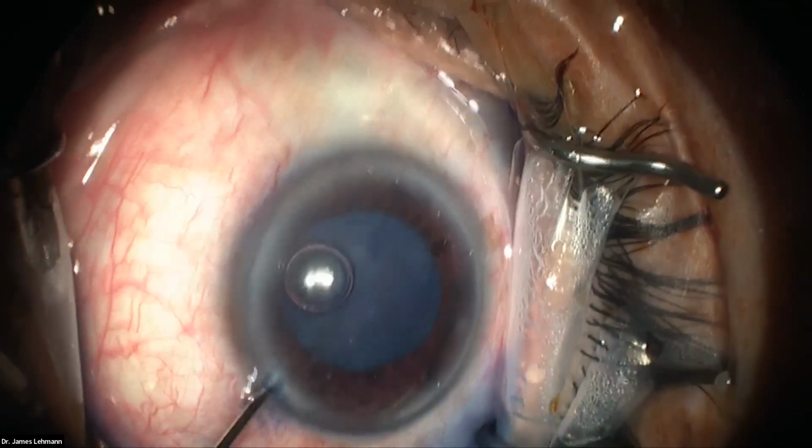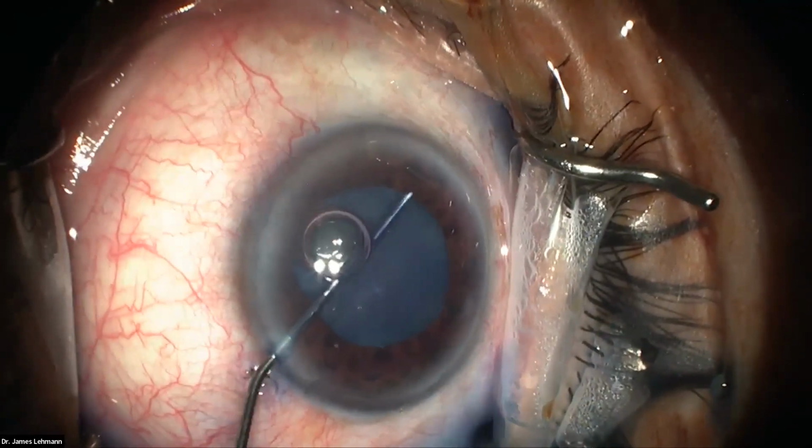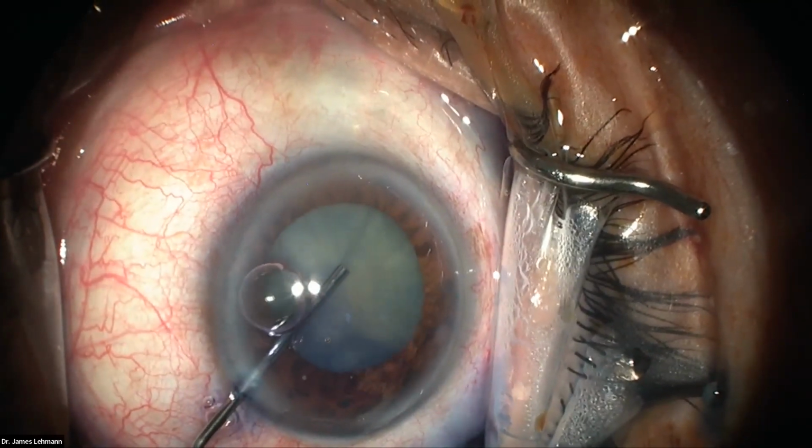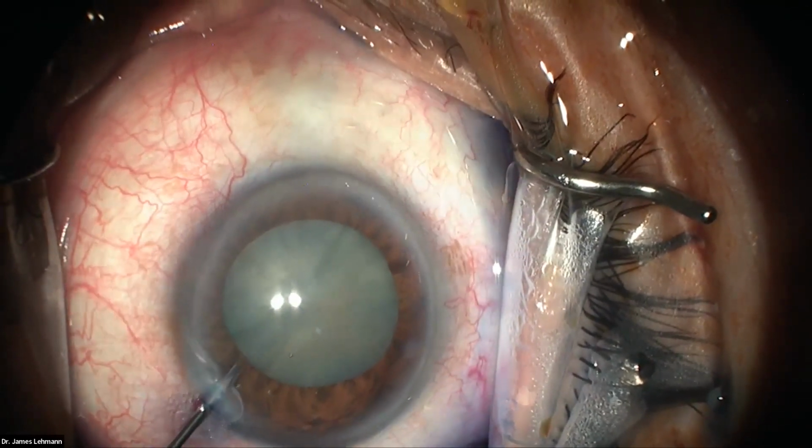Okay, and so when I inject this, I go all the way across the eye. And then I start injecting, and you'll see it'll start clearing away the rest of that trypan blue and that little bubble I had there.